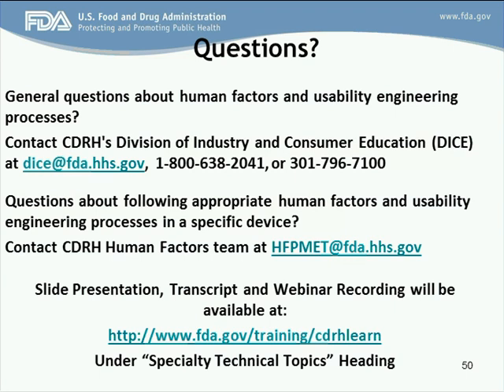Okay, that makes sense. If you have information for safety, risk mitigation that you need to evaluate, that could be evaluated through a knowledge task where you make sure they understand the posted contraindication, for example. Yeah, and correct.